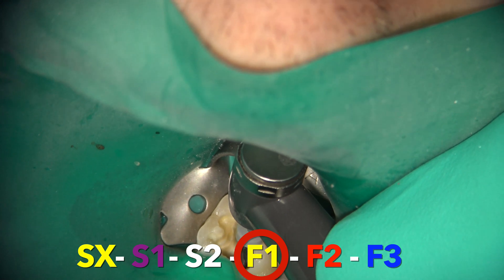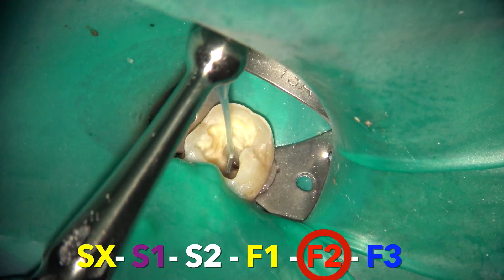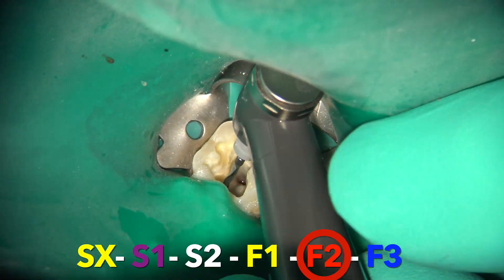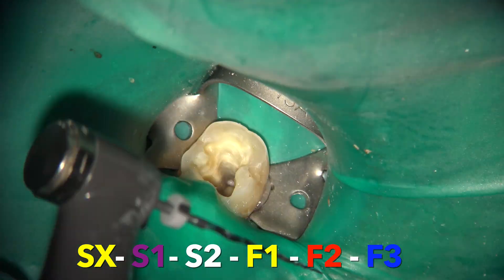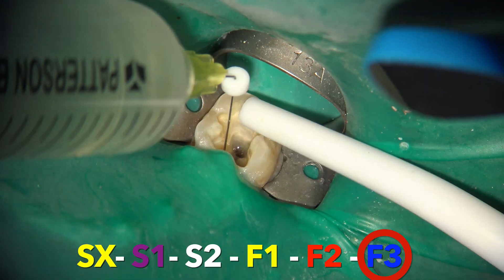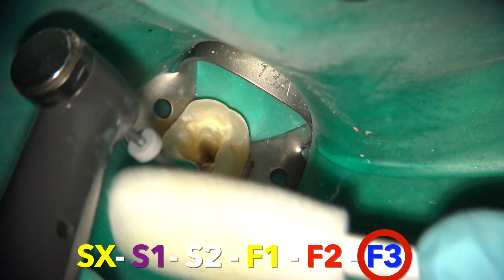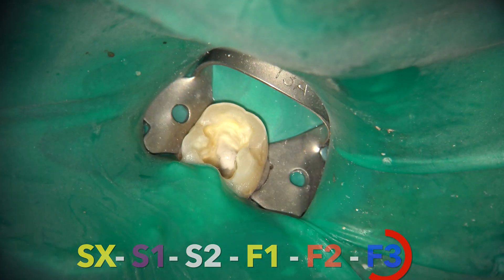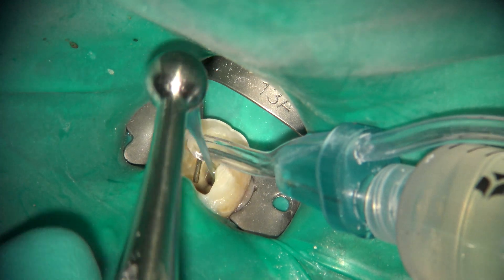We've moved on from F1 to F2. The F2 is one of the finishing files. Most of the time on a molar, once you reach the apex with the F2, you're pretty much set to finish. In this particular case on the distal, we had a fairly large canal, so I decided to move on to the F3 for a slightly larger preparation. It's very important throughout the process, as you move from one file to the other, to continue to irrigate and remove debris from the canal using ultrasonics and irrigation in a positive or negative pressure way. The F3 now moves down very nicely and cuts a fairly aggressive preparation. Remember, these file types were originally designed for warm vertical condensation, so you end up with a fairly robust preparation.